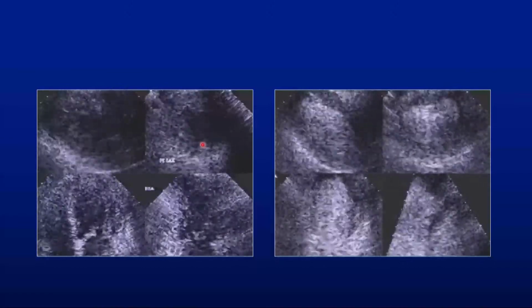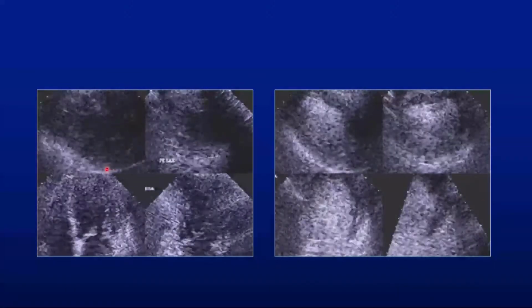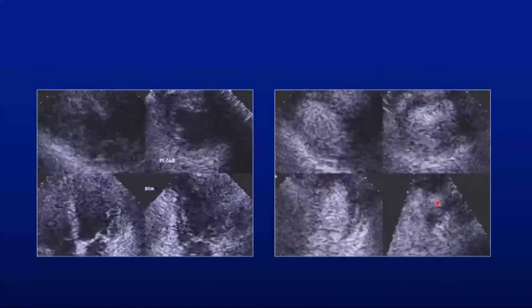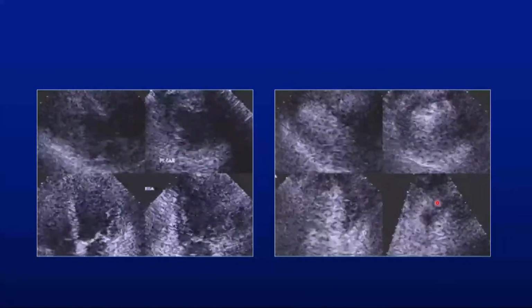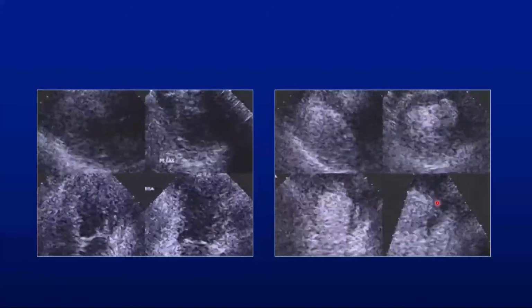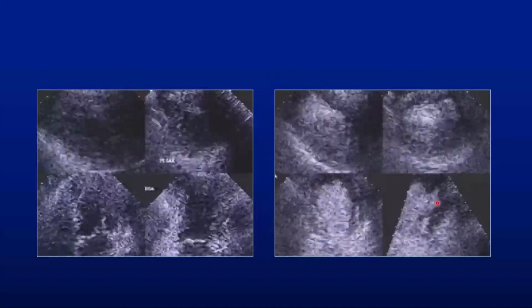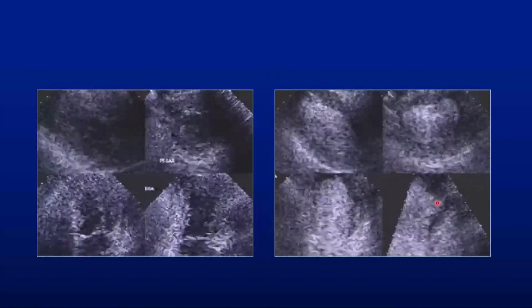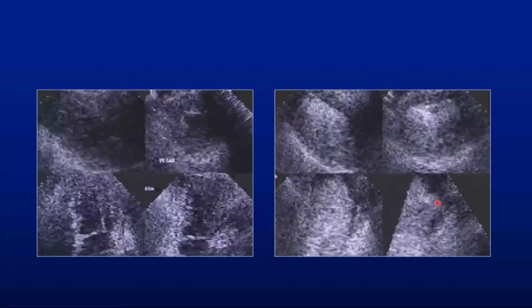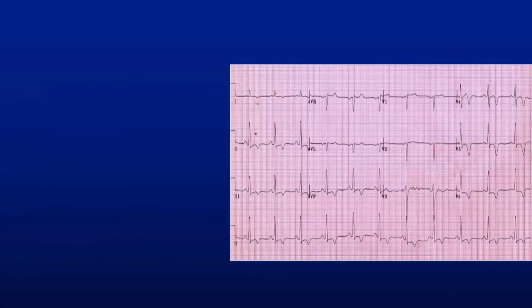That's what happened. I couldn't see the lateral wall well, and here you go. You got what looks like a pseudoaneurysm or aneurysm, turns out to be an aneurysm, in somebody who had a lateral infarct. Very unusual place, but real. I haven't seen a similar case since then, but that's okay. This is a teaching conference.